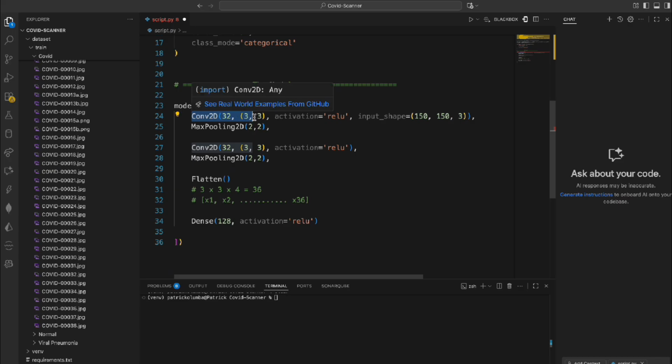I'm going to put it like this here. This one connects to this, and this one connects to this. This one flattens everything, and this one now is connecting to this. This is what is going on, right? So it learns combinations of the detected features, for example the texture, the pattern, the pneumonia, whether it is clumped up together, if it's a lot. This is basically what the dense layer is. It is another layer added to the previous one. The end goal here is to make sure we train this model and it becomes good.